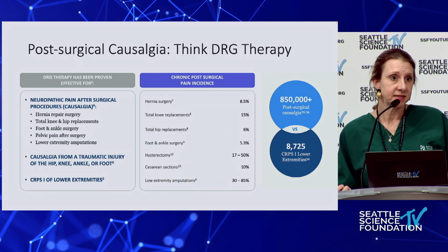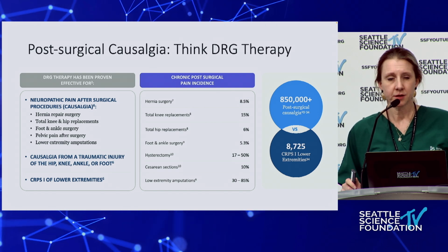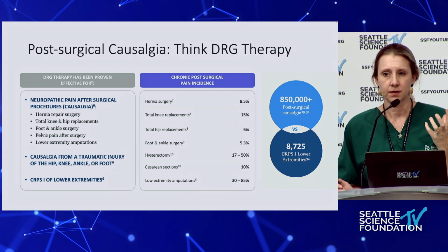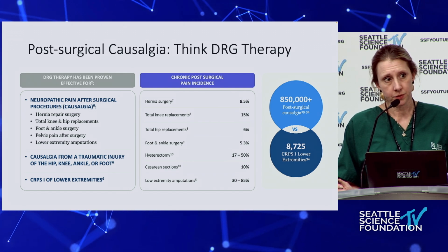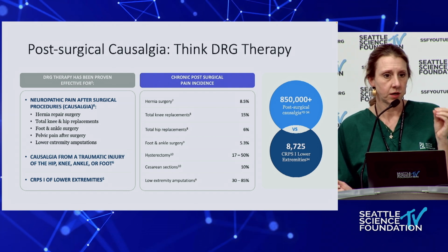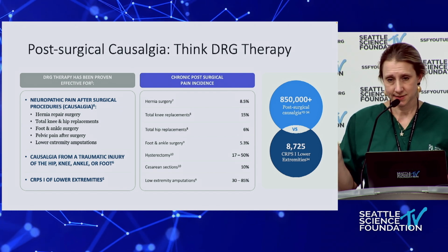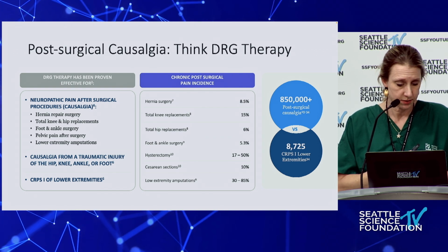Post-surgical, so these are some cases. When you think about the ideal candidate for DRG, as we said, you're going to be looking for a specific dermatomal distribution of neuropathic pain, like an ilioinguinal neuralgia, where you know that in all likelihood this is T12 and L1, and you can target that. Similarly for post-surgical causalgia, where you know clearly what nerves were transected and can trace those back to know the greatest dermatomal contribution to those.